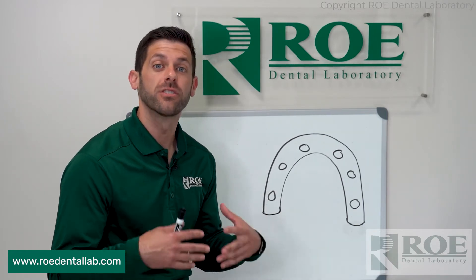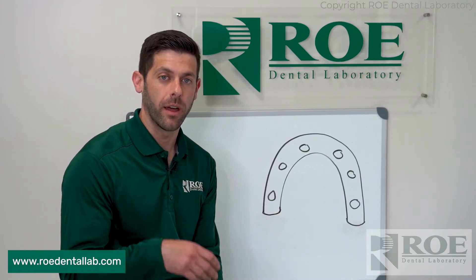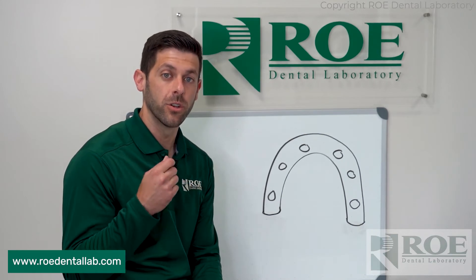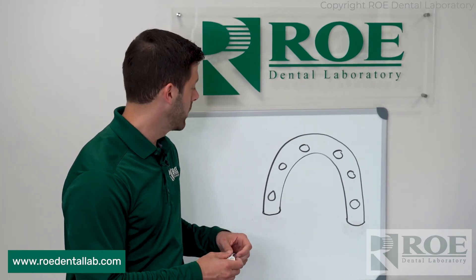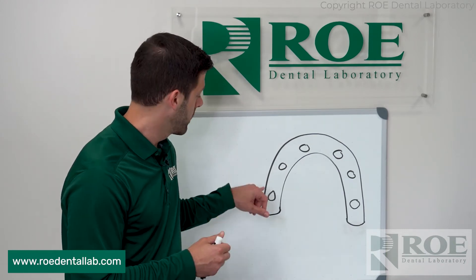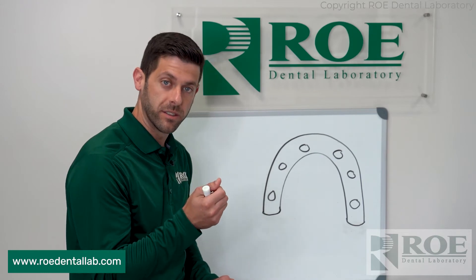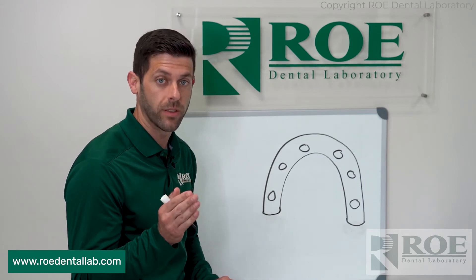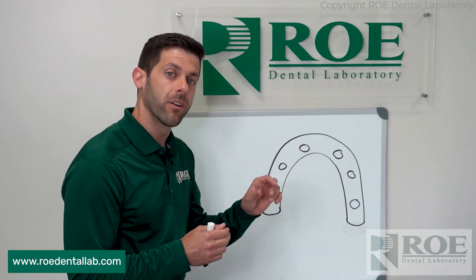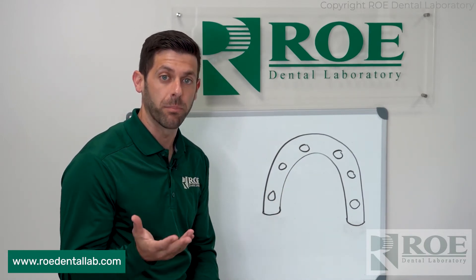So how does the one screw test — Sheffield test — work? We have the patient sitting in the chair, MUAs are exposed, and we seat their new printed try-in. We seat it and screw in — just hand tighten — the posterior most implant. Once you get it snug, again just hand tighten, don't crank it down. You want to look at all the other sites: if they are lifted up even a little bit, then that's obviously a problem for passivity.